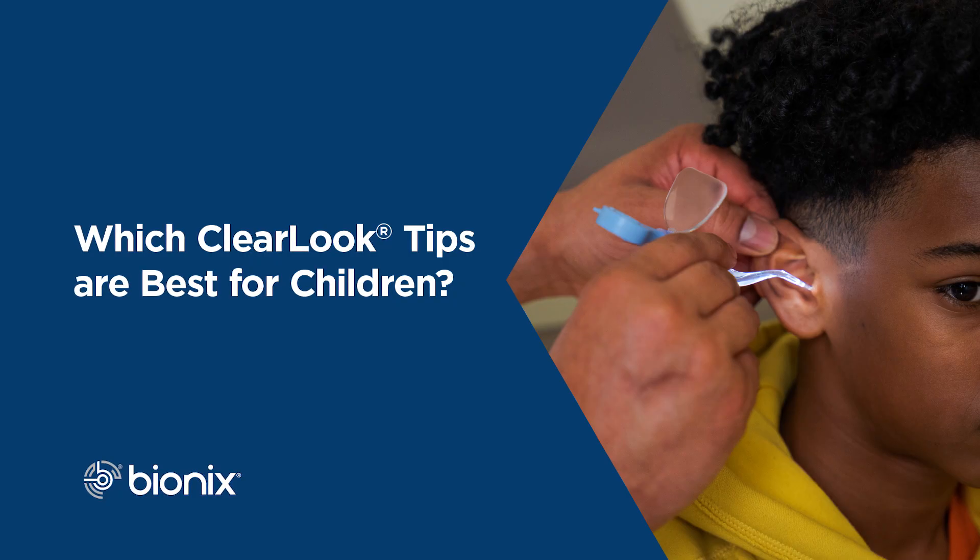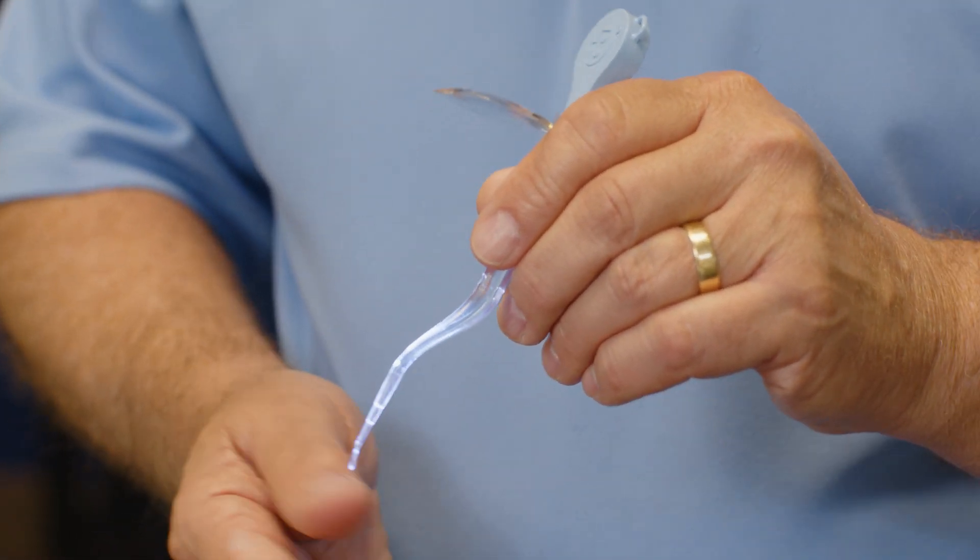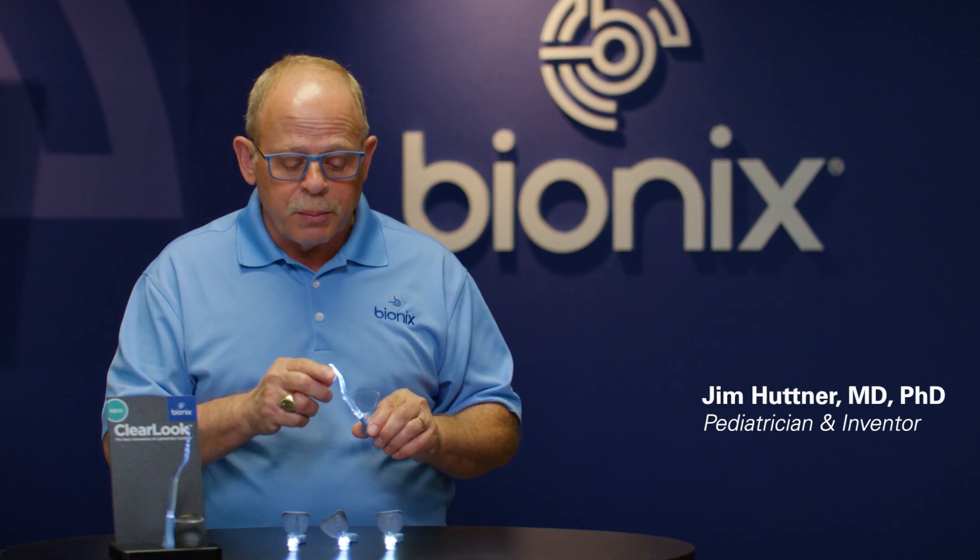Clear Look Ear Curettes come in different sizes intended for smaller children with smaller ear canals and also for adults with their larger ear canals. The curettes intended mostly for children are the Micro Loop, the Infant Scoop, and the Versa Loop.